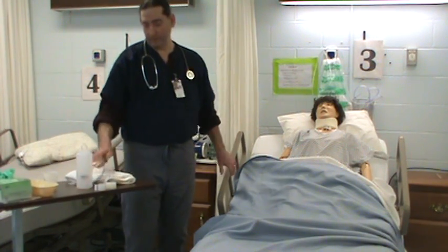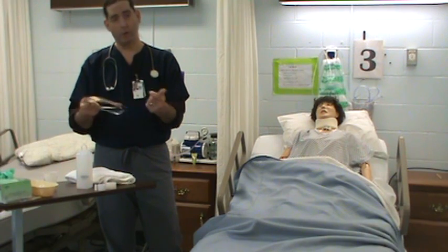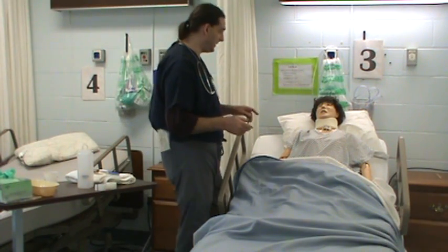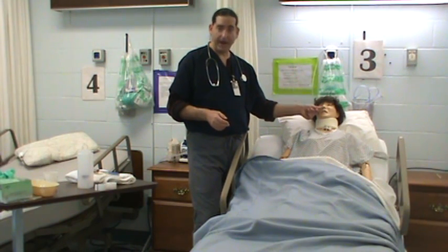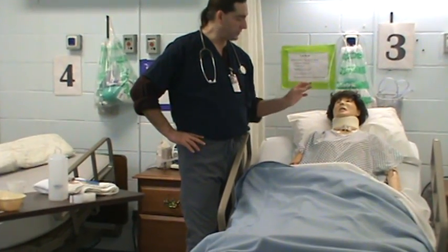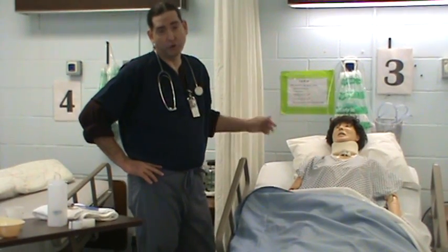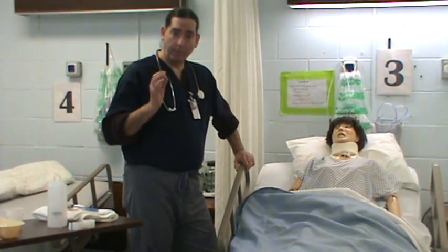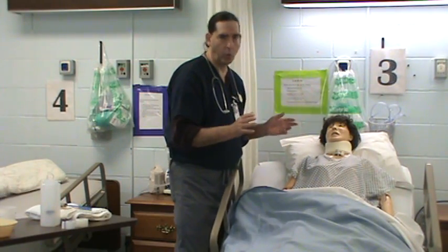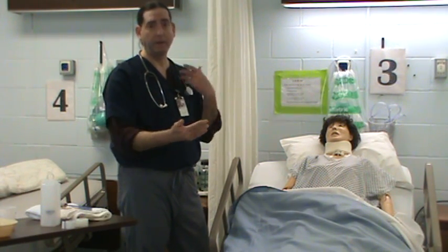So this is the Sim Lab. This is the NG tube I'm going to use — it would normally be in a packet I'd have to rip open, but that's the only thing I'm not going to do. The mannequin does have nares, but it's very, very difficult to slide the tube down. Also, you do not want to use lubricant on these mannequins because it'll somehow degrade them. So when I put the NG tube down, I'm just going to go through the motion — not actually place it inside the mannequin — but I'm going to do the motions and say exactly what I'd say.